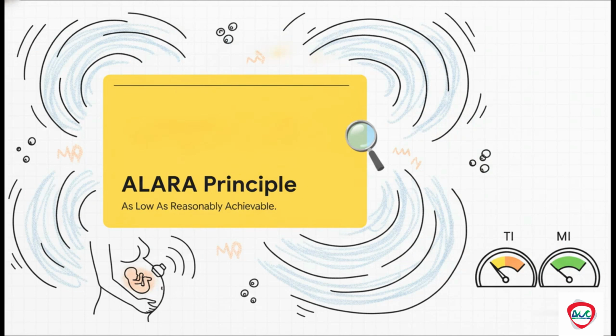Yes, ultrasound is exceptionally safe, but it's still depositing acoustic energy into human tissue, which can cause microscopic heating or cavitation. We absolutely must follow the ALARA principle, as low as reasonably achievable. Only use the power and scanning time necessary to get your diagnostic answer. Always keep an eye on your thermal index, or TI, and your mechanical index, or MI, right there on the screen, especially when you're doing delicate early obstetric scans.